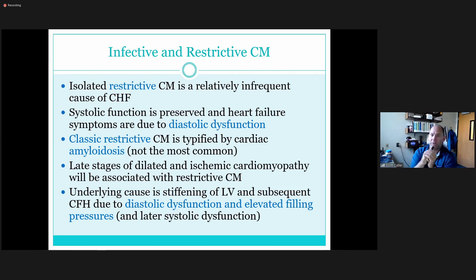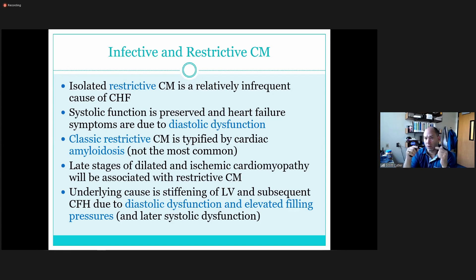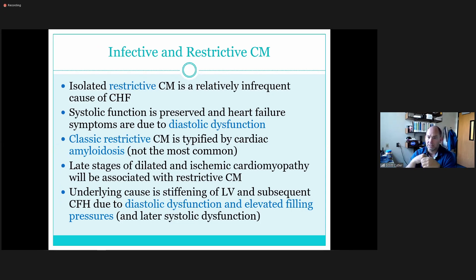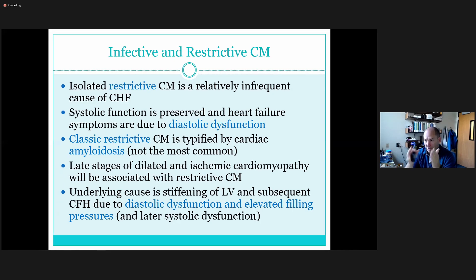We're simply looking for a reversal of E and A. Then we do tissue Doppler — as diastolic function becomes worse and worse, velocity gets lower and lower. These restrictive ones are super low — if you're scanning in a clinical setting you're likely down at like four centimeters per second, which is very low. Typically we're over eight; normal hearts are between 10 to 20. Then we also have pulmonary venous flow — comparing A-duration, A-velocity, A-reversal velocity, and the S-wave. The biggest one on pulmonary veins is the A-reversal: its duration and velocity.